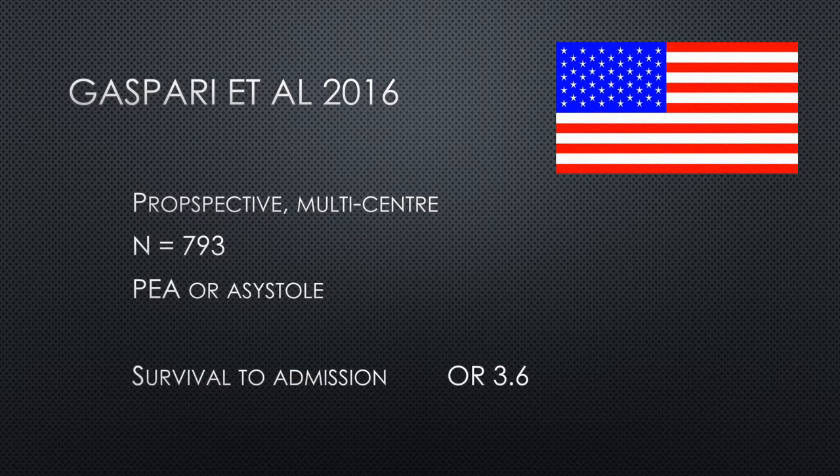And they found that the presence of cardiac activity had an odds ratio of 3.6, which was statistically significant for predicting survival to admission, so making it to intensive care. But this paper also looked at various other subgroups, and so we'll be referring to this paper quite a lot over this talk.